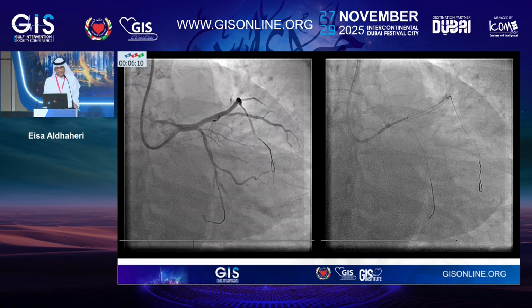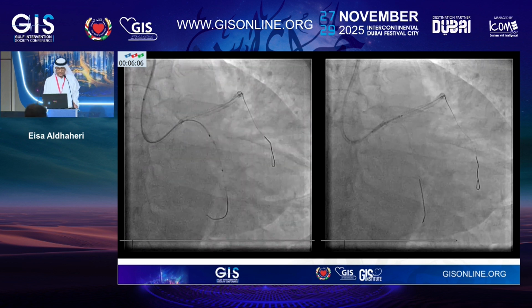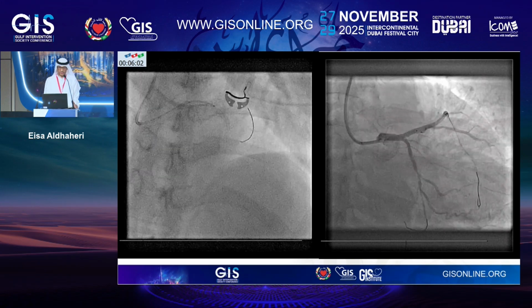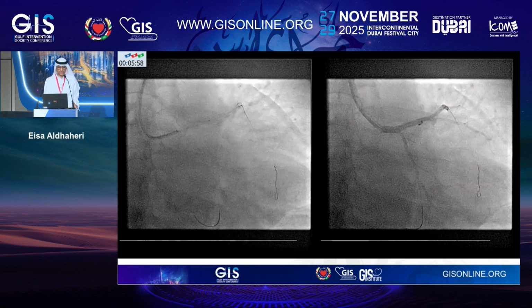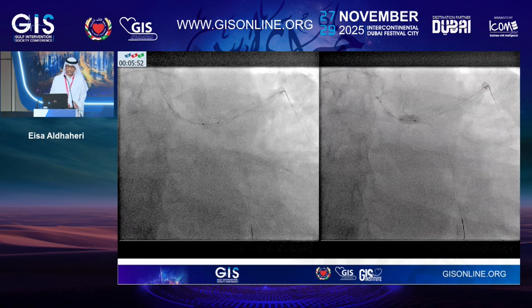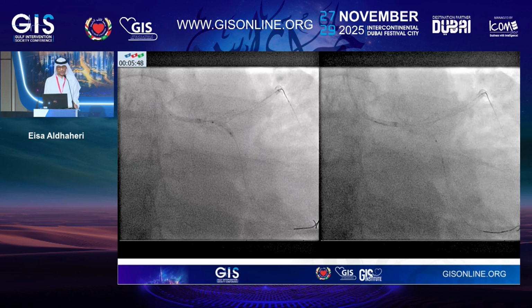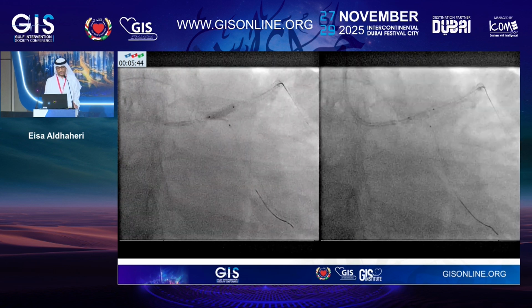So after that, we decided to do PCI to the left main LAD. It's a provisional stenting, and we sized the stent based on the OCT. I put a stent on the left main LAD as a provisional stenting, and then I did the POT for the proximal part of the left main. I did side POT for the circ, and I did final kissing.